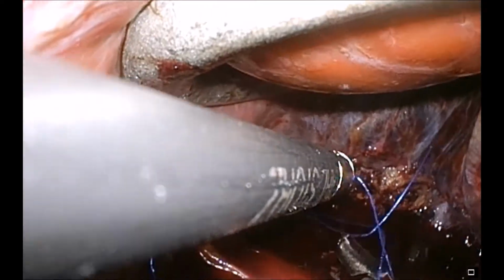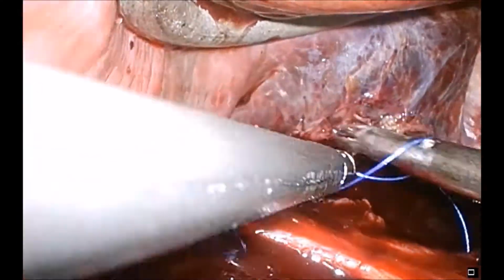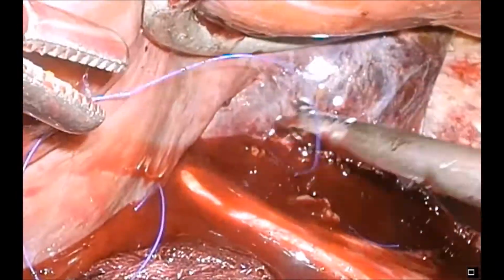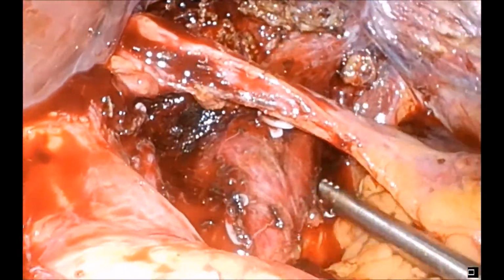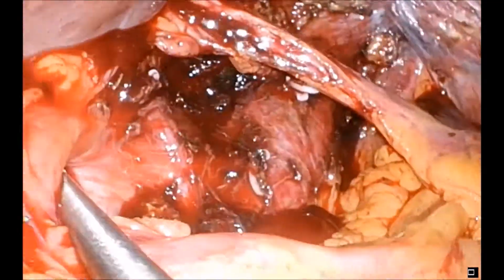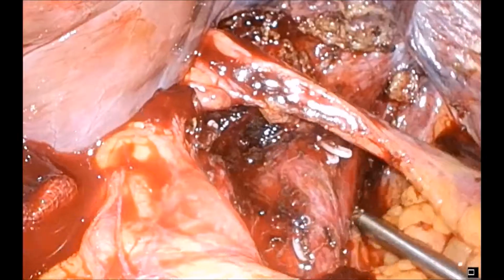And while this little bit of blood looks dramatic, it's actually very little. Once that was done, things were relatively quiet from a bleeding point of view.